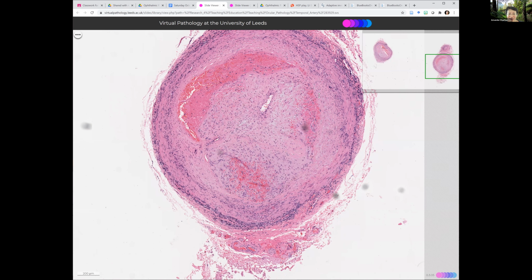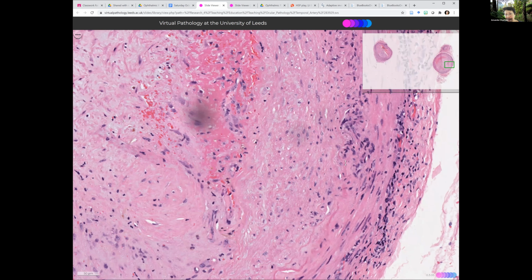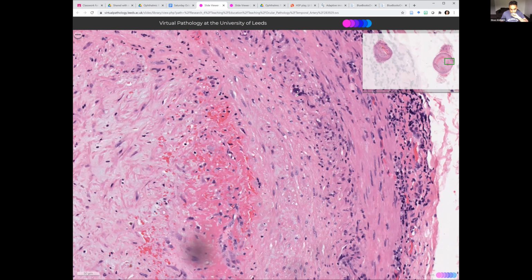But atherosclerosis should have calcium in the walls and should not be concentrically inflamed like this, and should not have destruction of the internal elastic lamina by giant cells and inflammatory cells. I think this is a giant cell there. It's just squished. Quite often in atherosclerosis, we get reduplication of the internal elastic lamina. Yeah, this has been destroyed.